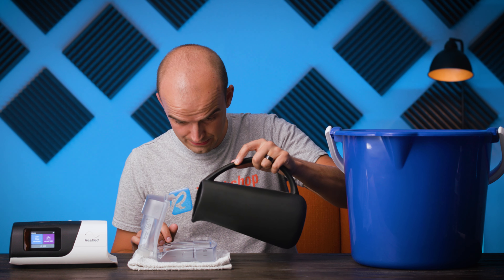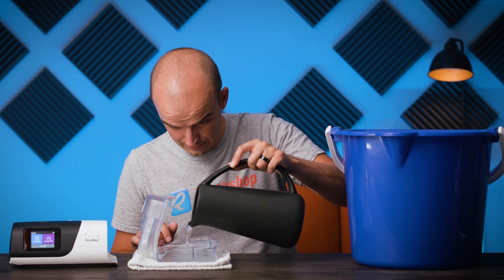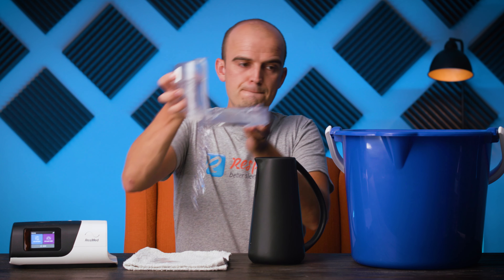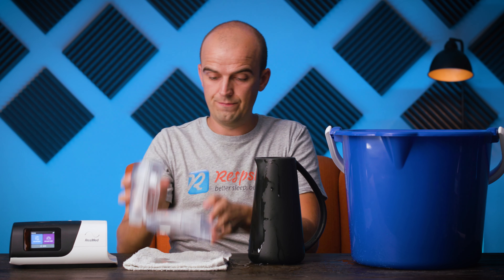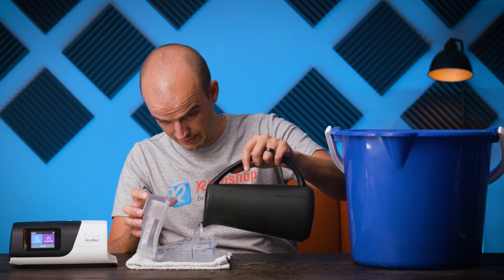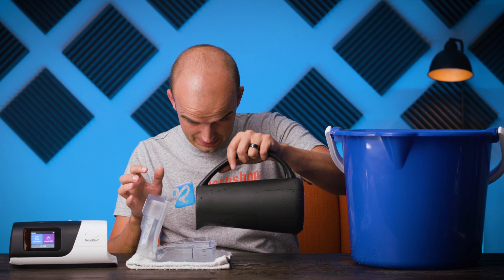A little more, little more... ow, ah... let's go again, a little more, little more... I give up. Time for a resp shop hack.